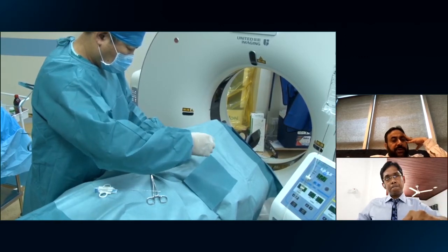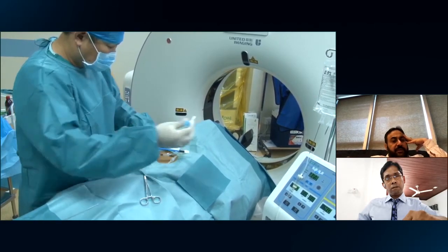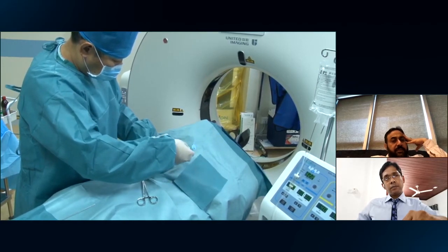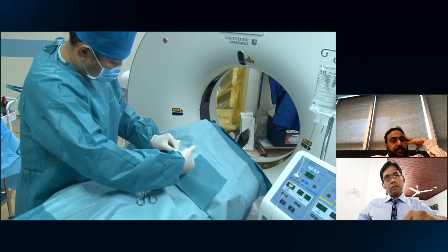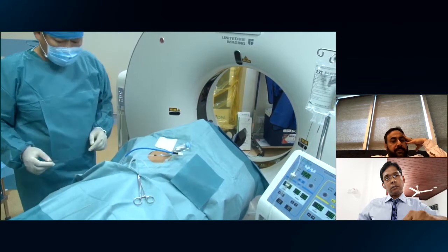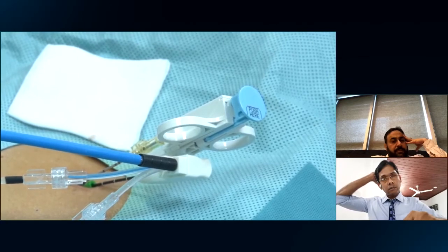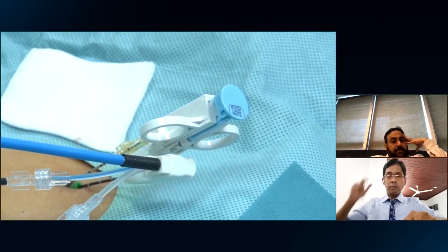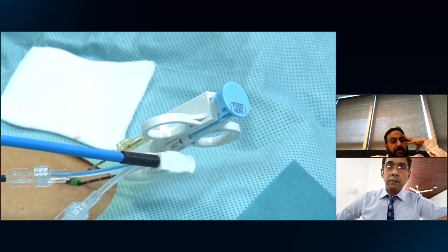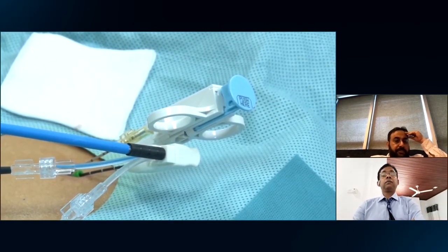So probably you are going to take a 10 millimeter core, single click rather than double click. Double click. Okay, double. And insert. Place the biopsy. So we still need another scan to ensure the tip of the biopsy needle is in the right position.